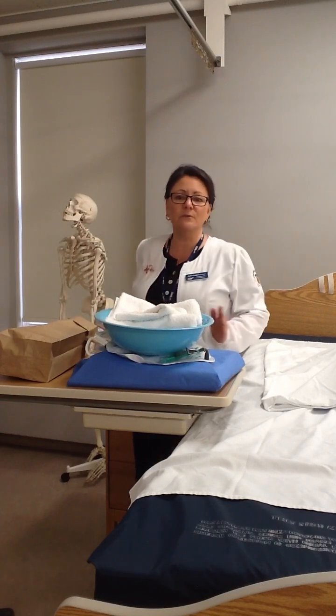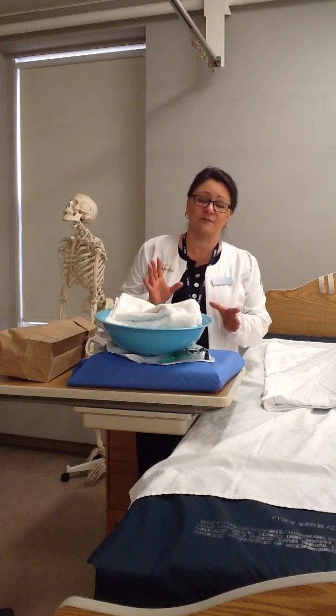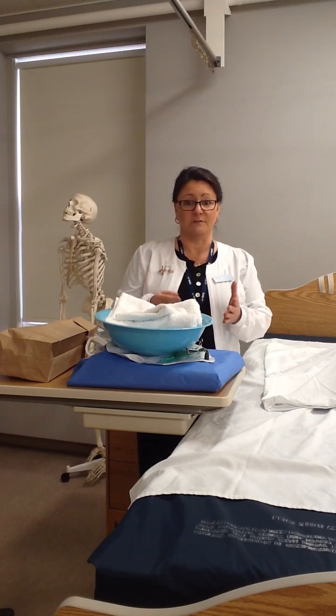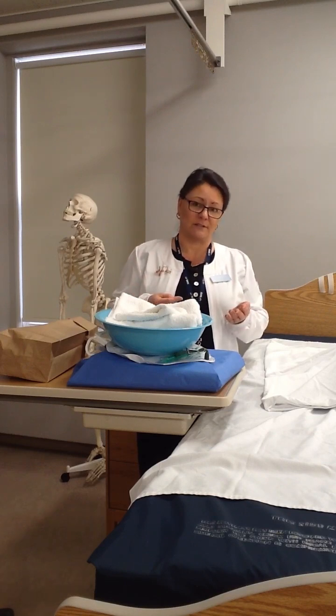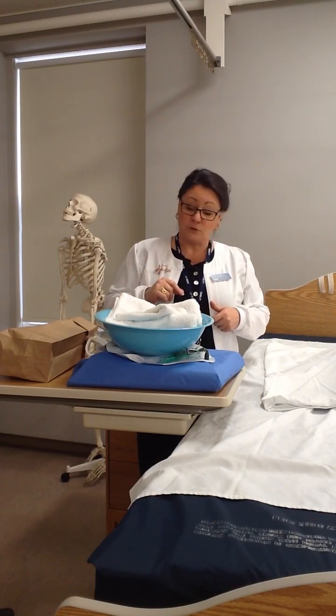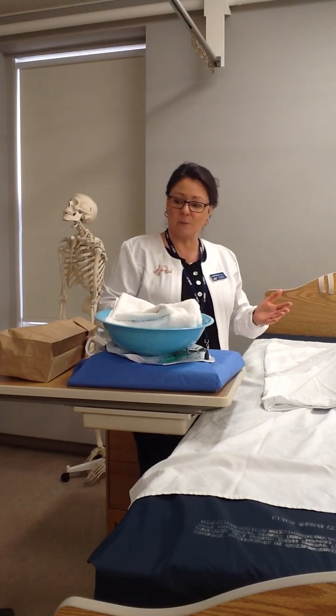And I want to be able to move them behind me once my sterile field is open, so that I'm never taking my eyes off of my sterile field, which is another one of the principles of sterile technique. We mustn't ever take our vision off of our sterile tray. So I'm going to, as I said, provide privacy, close the door and close the curtain, and I'm only going to expose the area that I need to expose.